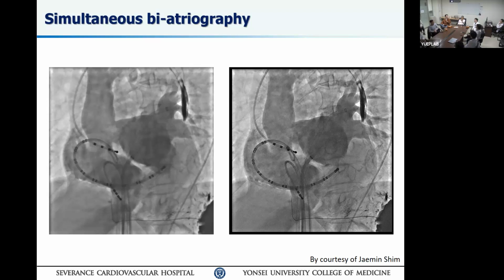So the key is to pay attention to the needle, which is already pulled back into the dilator. Keep looking at the dilator when you're pushing it, and make sure they don't come back out. So keep firm pressure. Another tip: if you cannot advance the sheath over the dilator, twist it a little bit back and forward, so that you make the hole a little larger and it pops in. Don't try to force it, because inexperienced fellows remove the dilator and do not push the sheath. But you can always get back in, so don't worry about those. Those are minor things. But it is important to remember that your needle is flexible.